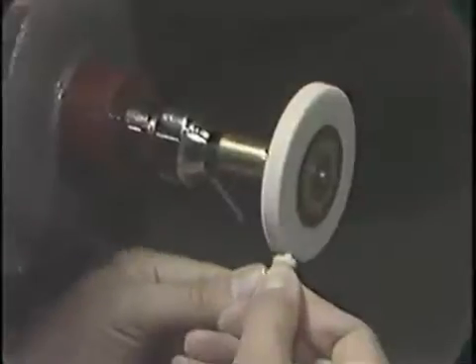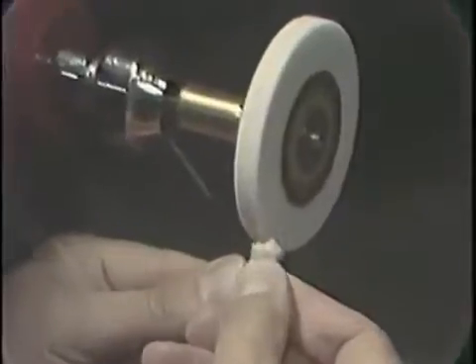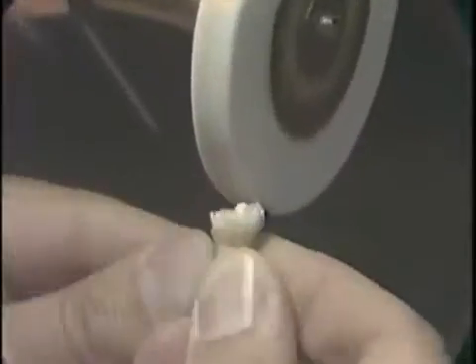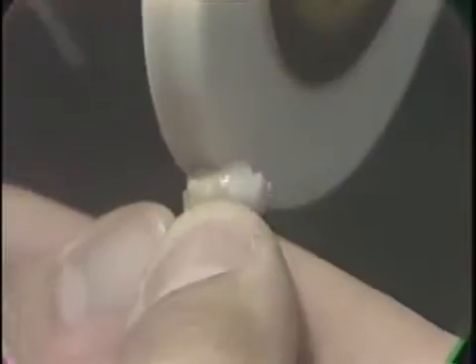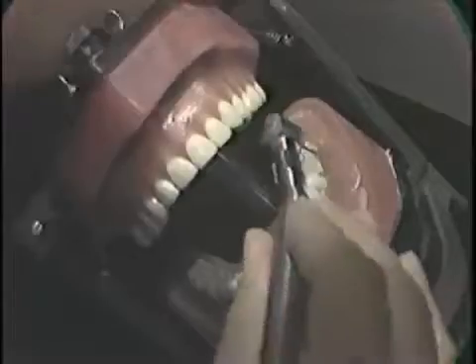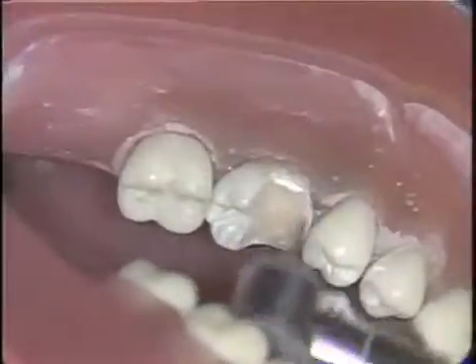Another technique which may be used to rapidly remove the tooth tissue is the rapid cut stone mounted on a dental lathe. Using this technique, a shoulder must be developed and refined using a carbide bur or a diamond instrument to create a flat area for the subsequent placement of pins.